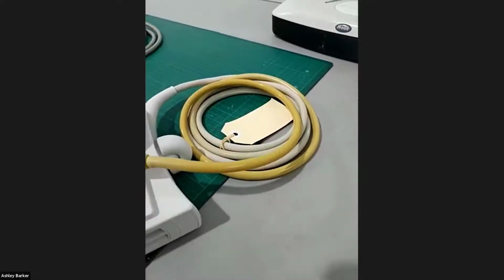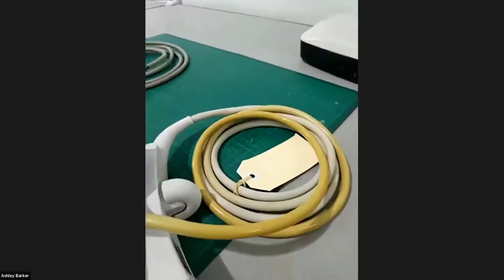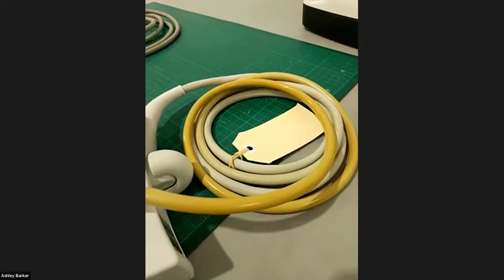It's not a getting hot sort of thing? Yeah, I don't think it is. I think it's probably more related to some sort of chemical issue. Okay. But I can only imagine that it looks about the colour of betadine. Yeah, I was thinking that as well, but then it should be a bit uneven, because unless you're dunking it totally in the betadine, you'd expect it to be a bit uneven in appearance. Does it look fairly even when it is coloured?